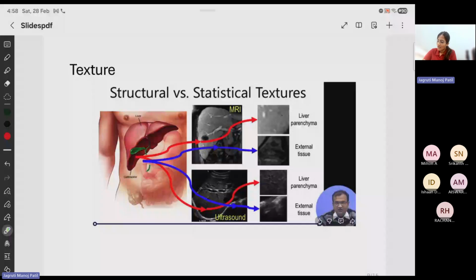In ultrasound you have some regions that are hypoechoic, hyperechoic, and anechoic. So you have different regions here. These are cases such as a fluid-filled cyst, a solid tissue or tumor, or a stone or bone in between. So you'll get different regions there, and that's how your scattering will also differ. Which type of texture, which nature of texture you should look at, depends on the modality of imaging also.